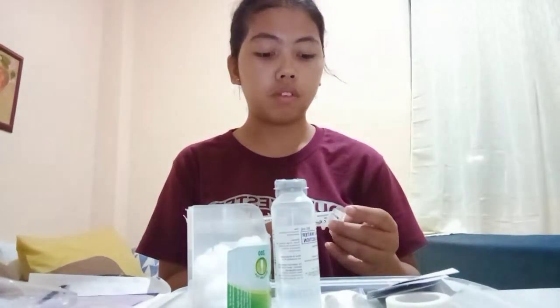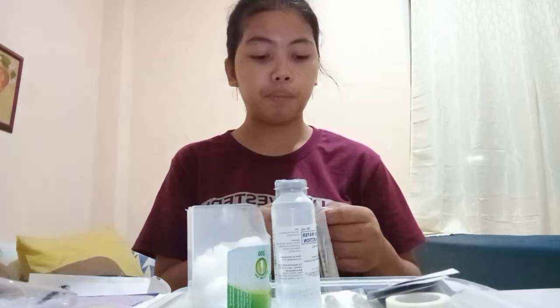Before we proceed to our intradermal injection for skin test, we should perform hand hygiene and observe other appropriate infection prevention procedures. Now we are going to prepare the medication from the vial or ampule for drug withdrawal. For now, we are going to use distilled water or sterile water for injection. So now I am going to withdraw the sterile water with the syringe.